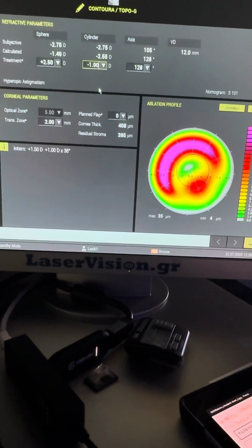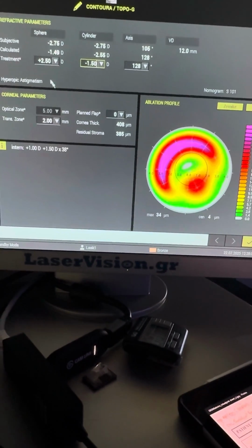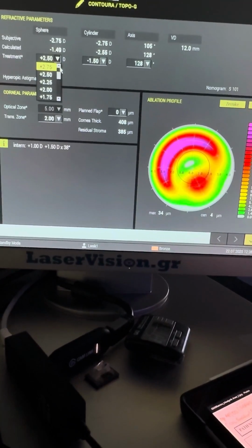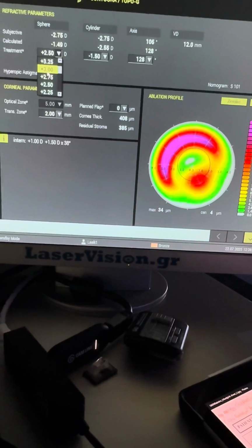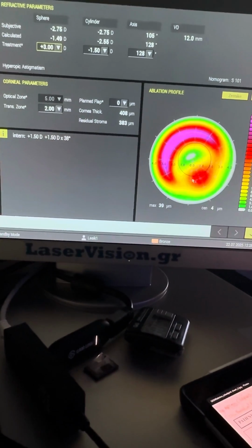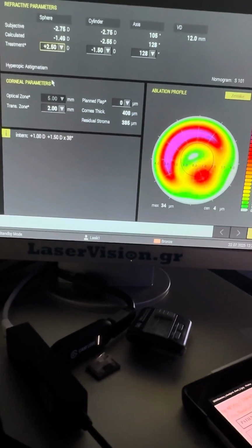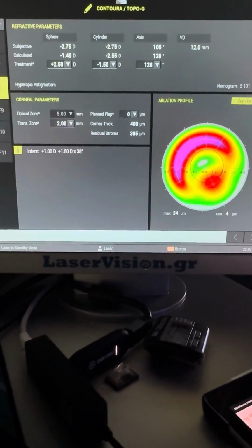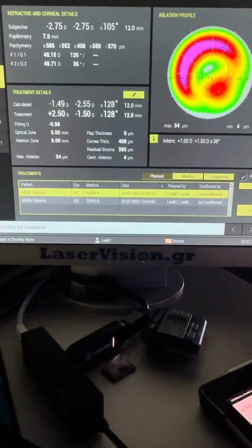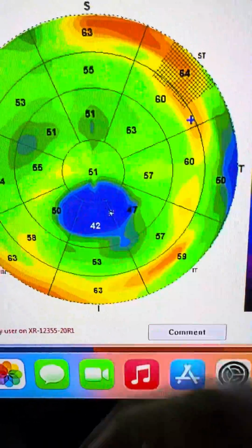Let's see what happens when I reduce the astigmatic correction. Not much of a difference, so we can definitely work on this. And I'll go all the way up to +3 because I really want to take away the treatment over the cone area. So when I go to +3, there's very little treated here. So I'll stay with a +2.5. This will be our treatment, transepithelial, because we will proceed after this treatment with removing 40 microns of epithelium in order to use the remodeled epithelium as a masking agent.